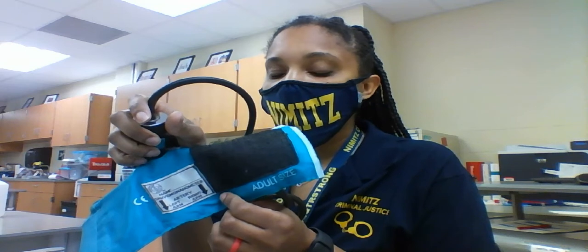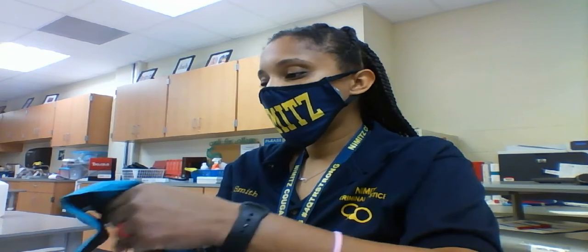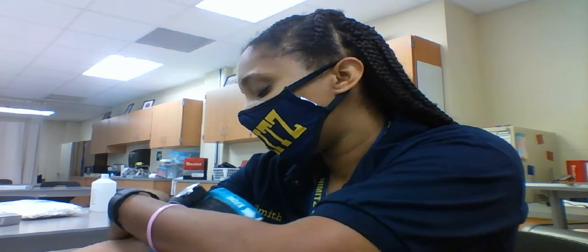This one says right arm, left arm. Most just have an arrow or a red dot, something signifying this is the side that you put on the arm. Okay, so you're going to help me put this on. Because this is my right arm, we're going to line this up to the right brachial artery.